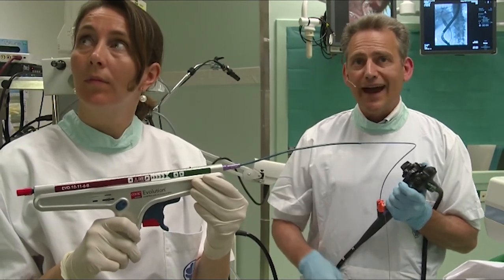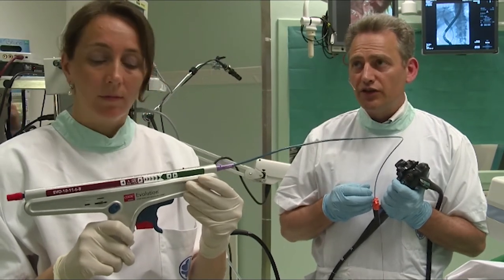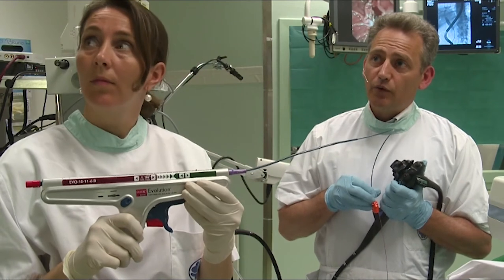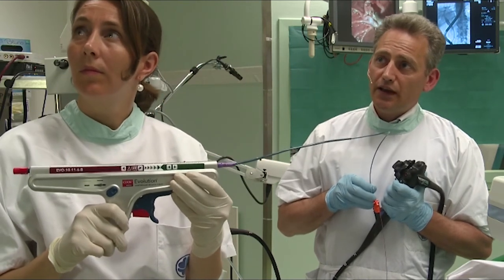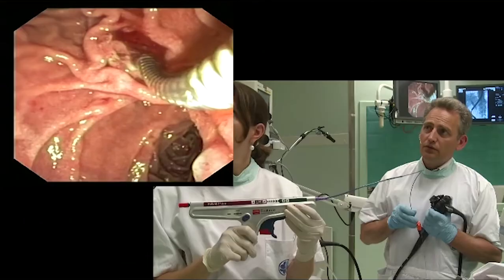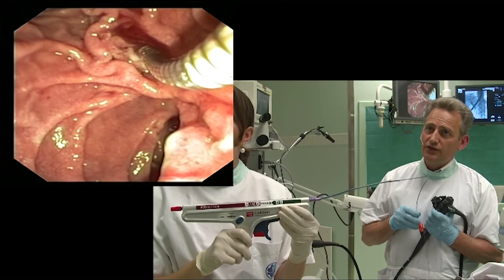The next thing is to accurately place the stent in relation to the stricture and also in relation to the ampulla. And what we would like is to have the stent deployed into the duodenum for a distance of about 1 to 2 centimeters. You can see this is very nicely visible now on the endoscopic view. We can see here the yellow marker and the transition towards the stent.